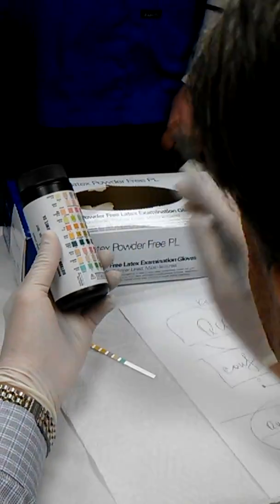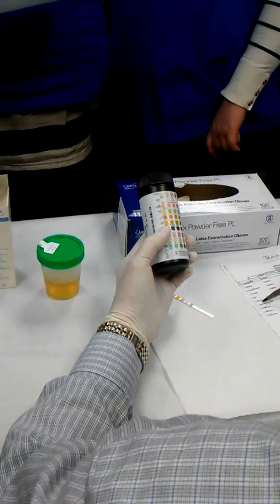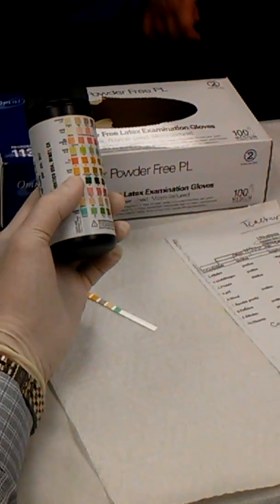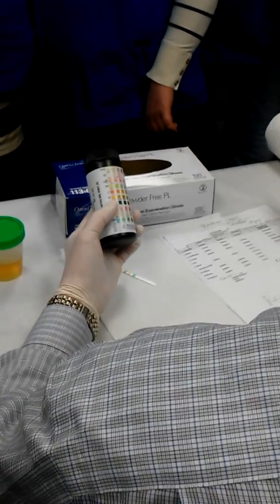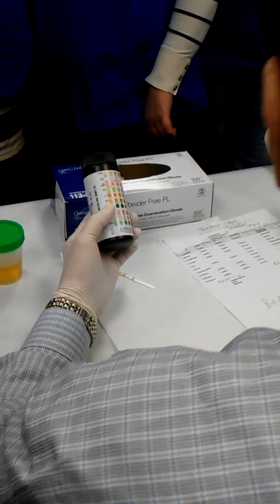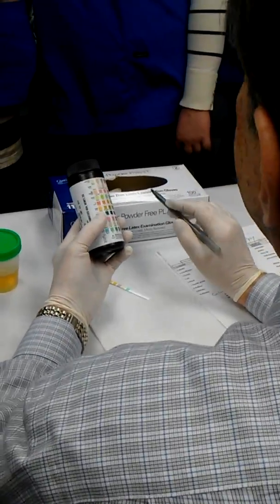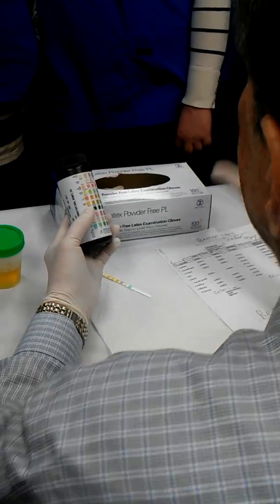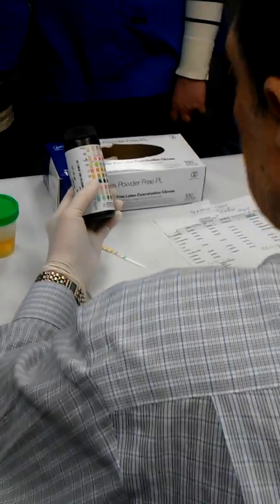Okay, next is blood. When people develop blood in the urine, first of all, of course, tumor. But second of all, it's stones in the urinary system. If people have stones moving, they irritate the mucous membranes, and we will have blood in the urine. And one more, it's infection. Infection, stone, and cancer. So if you see blood in the urine, it's absolutely not good. But girls, you know, they could have blood during periods. So if some of you have periods, you will not do the test today. Okay, next.